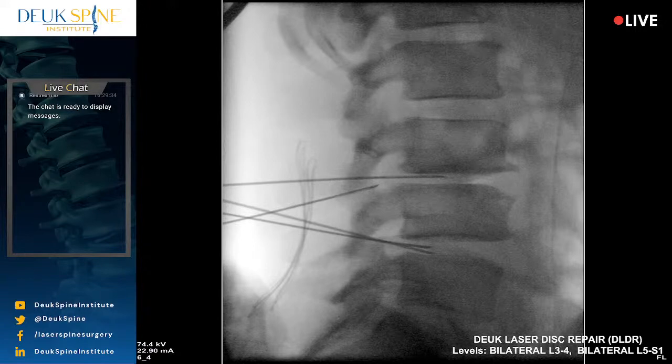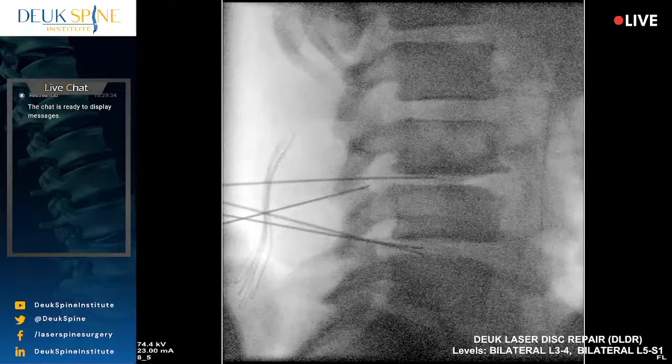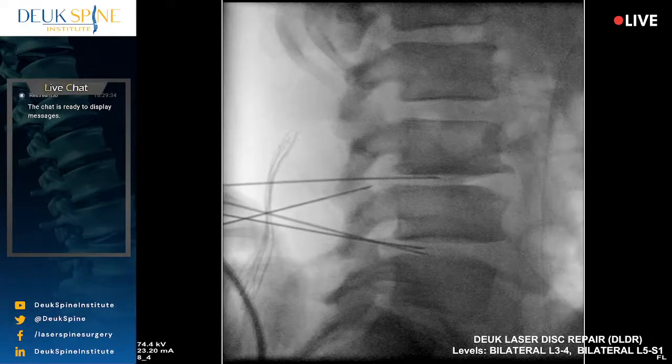The nice thing is when you have a patient with a herniation that's pretty broad-based, the more lateral your starting point, the more to the side your starting point. Yeah, that's perfect. Let's go back to a lateral view. So it's a little trick to doing endoscopic surgery, transforaminal surgery. The more to the side you start, the more across the middle you can get. That's pretty well known to most endoscopic surgeons. They know that. All right.